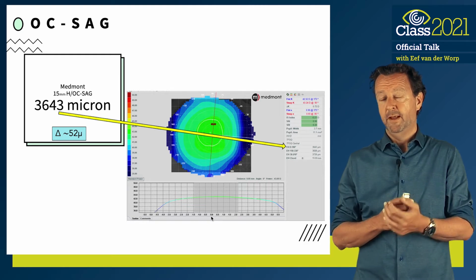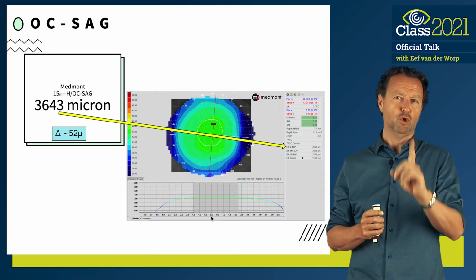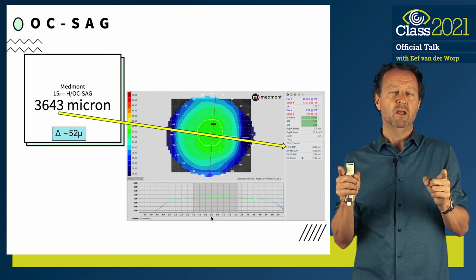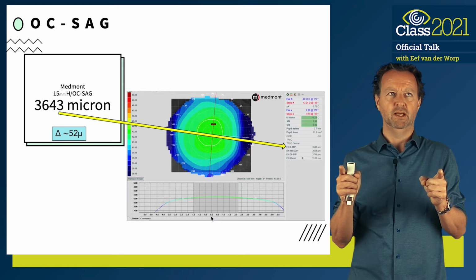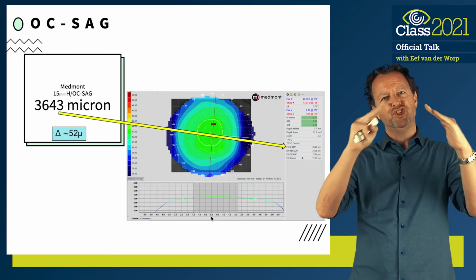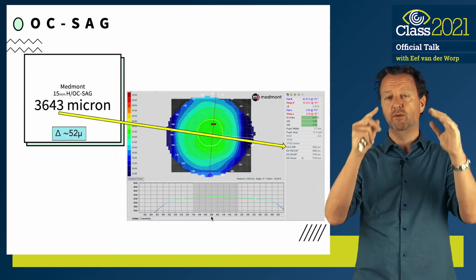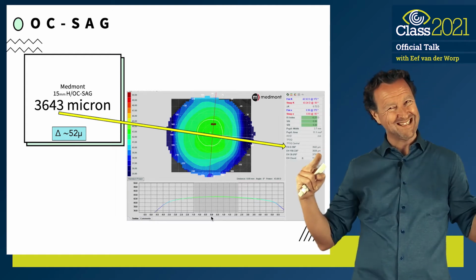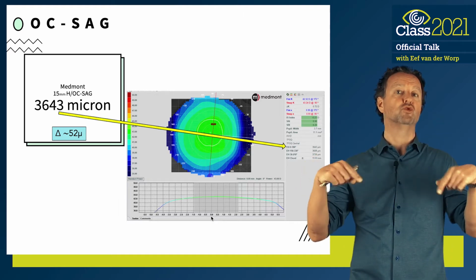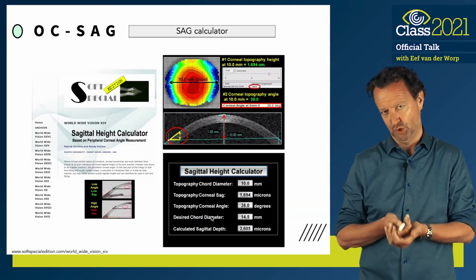So good stuff. Now, I hear you think, some of you at least, the smart ones, this is a corneal topographer, so how can that give me the 15mm chord? It's not that complex actually, since we know from our studies that the shape out there is a tangent, an angle. If you assume, and it is an assumption, but let's do that, that the peripheral cornea sort of extends out into the limbus and anterior sclera, you can use that information to predict what's going to happen out there. And that's exactly what instruments like this do.